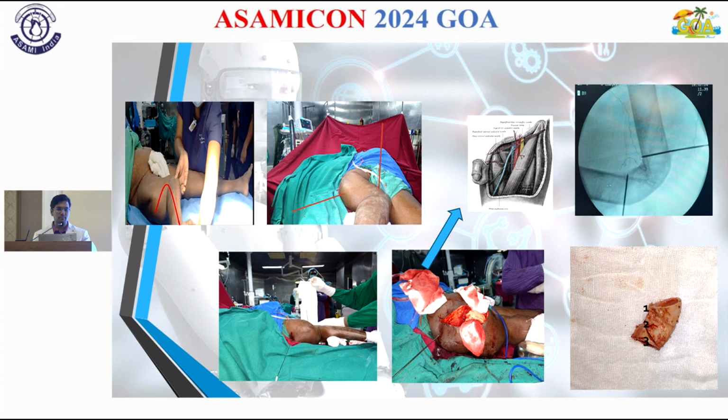Intraoperatively, we marked the vascularity using mehendi so that it would not be erased after the pre-wash. First we marked, using a Schanz pin, the rotation, how much rotation is there: this is the proximal femur laterally, and this is the distal femur laterally. Then the vascular surgeon was called for. He explored and had control of the proximal vascularity, in case we damage any vascularity intraoperatively. Prior to starting the surgery itself, the vascular surgeon was called and we got hold of the femoral artery and the profunda femoris, and the deformity was completely exposed.